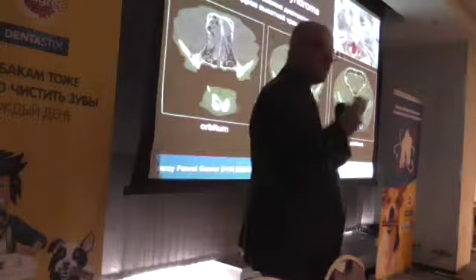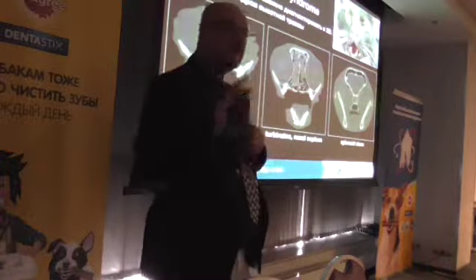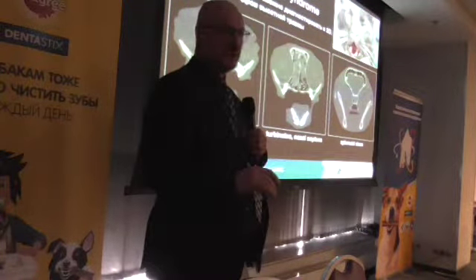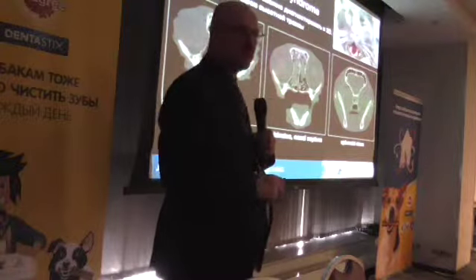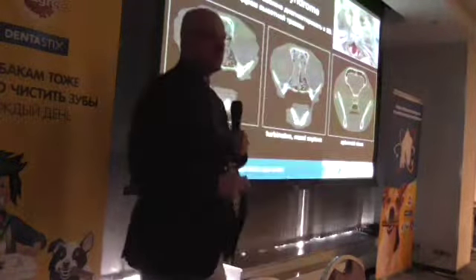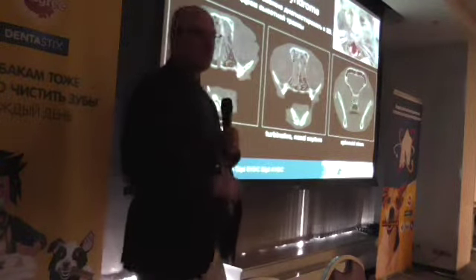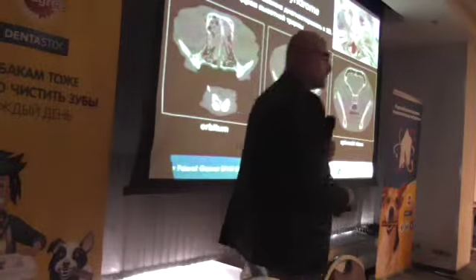So trauma is definitely the huge area of interest, and we do routinely every single patient the three-dimensional assessment, and it gives us a lot of information, and we have a feeling that we don't miss a lot of relevant details.